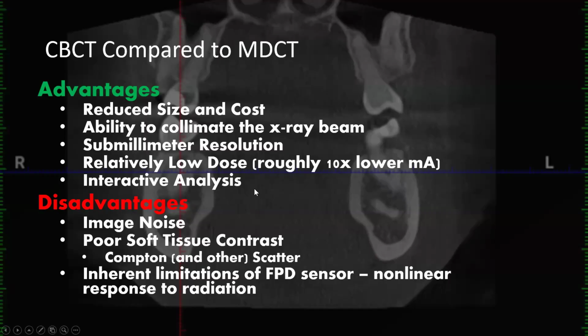And so when they prescribe something, they have to be very specific. If they wanted a TMJ view, they need to tell the technician, we want this TMJ view, or whatever certain view they want to see. And so that's a huge benefit of CBCT software.